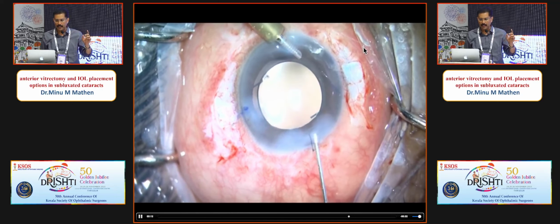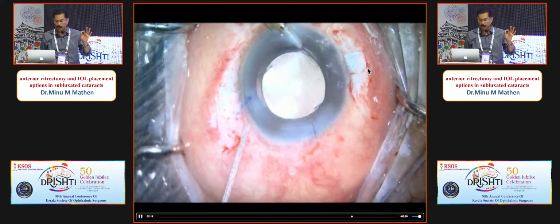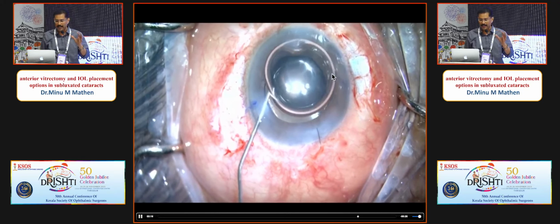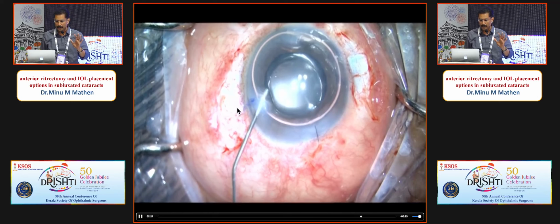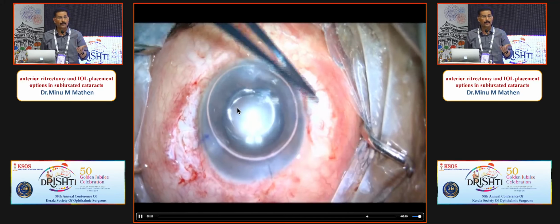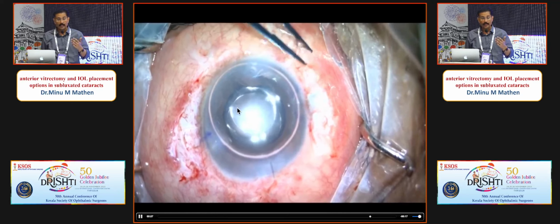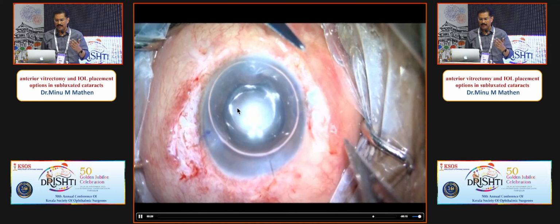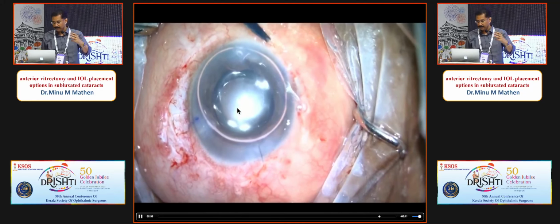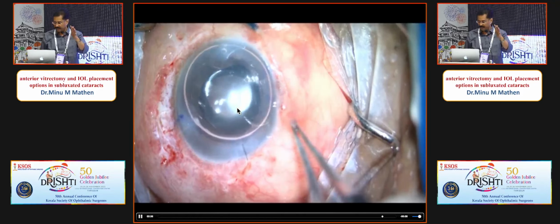You just suture the flaps with nylon suture, and then I put air inside so that there is no leak through the ports, and it has to be dry while applying the glue. And once it is done, it can be used for the conjunctiva also. But nowadays I suture the conjunctiva also because in many cases it tends to retract. So I don't want the flap to expose and all this.